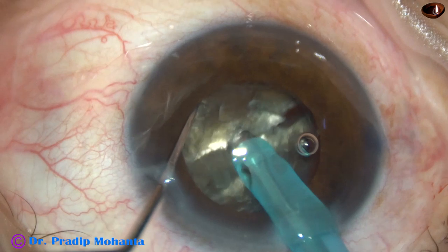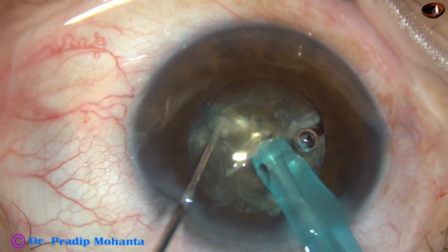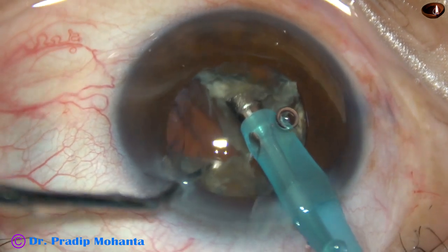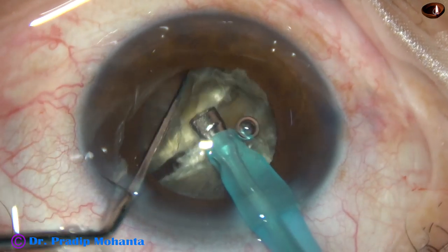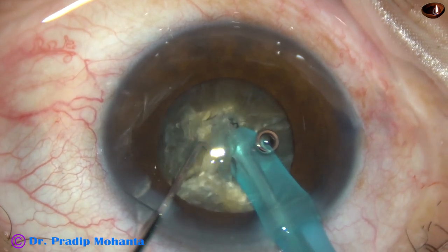Now each hemi-nucleus is subdivided. Again, the tip goes into the substance of the nucleus, goes near the equator, and then the chopper is used to divide it. This has been a complete division. It is rotated again 180 degrees, and the other hemi-nucleus is again chopped.